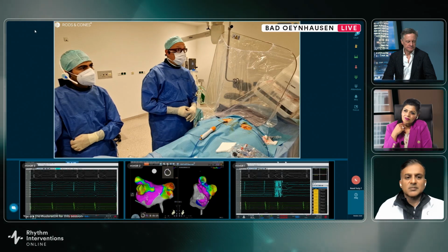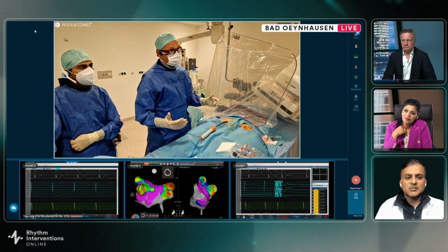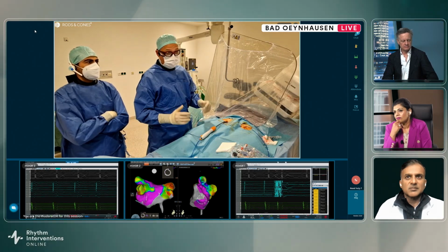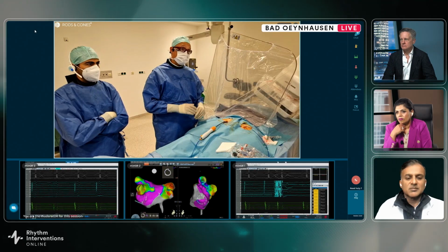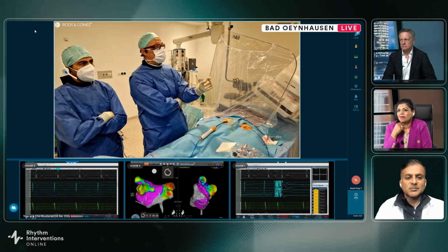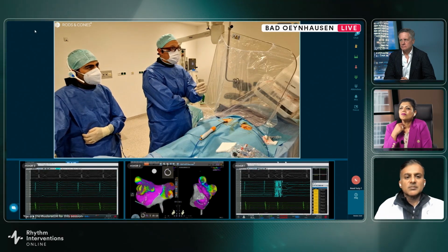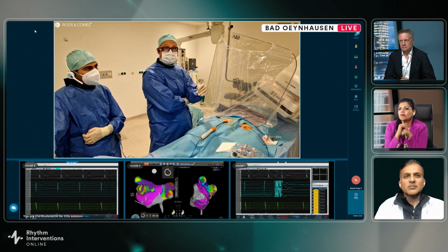I do not have 100% idea of the ideal catheter design. We also have experiences with lattice tip, large footprint, and so on. But at least you can see for the target pulmonary veins, this catheter seems to be very good and ideal, even though it was not so super easy to go to the left inferior pulmonary vein. Sometimes also the right inferior vein is difficult to achieve. We still need improvements, but for the pulmonary vein isolation, it's an ideal design.